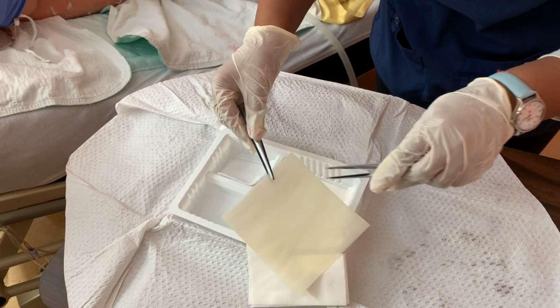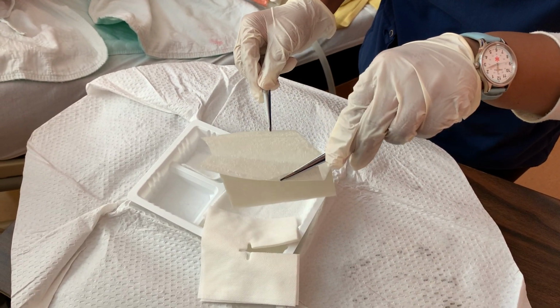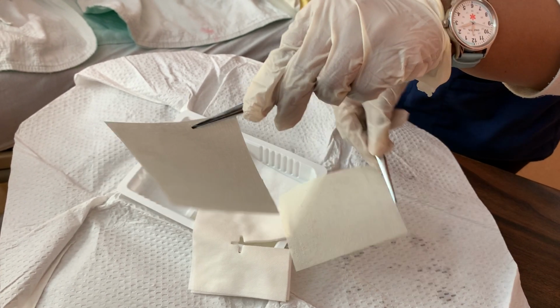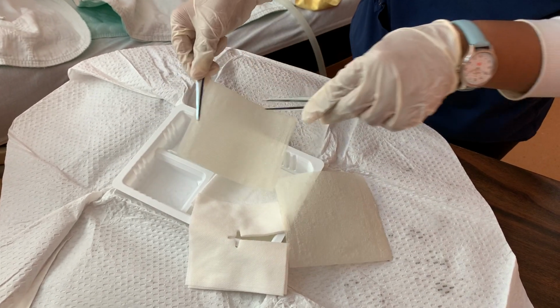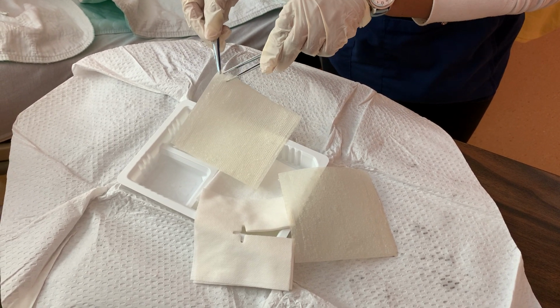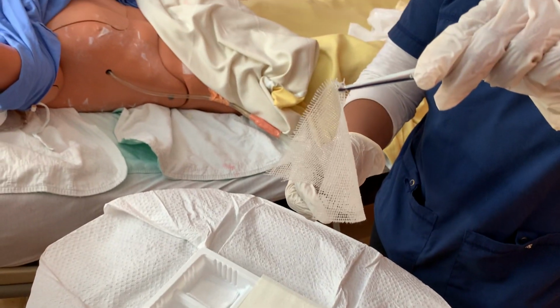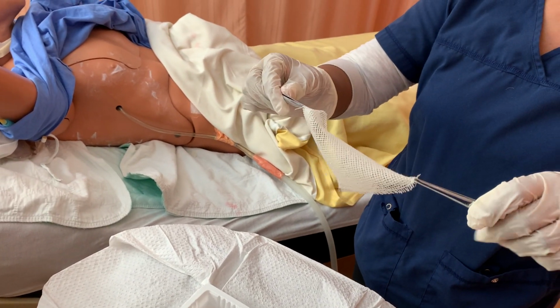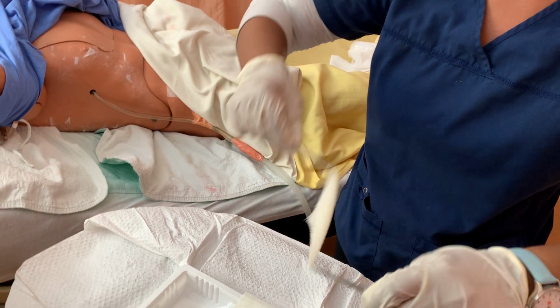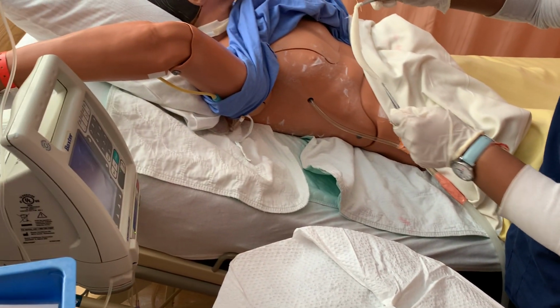I'm gonna do my Gelinette here. So this is just garbage. I guess we didn't think that through, so we had the little vials, and I think my finger might have touched this, so we're gonna pretend that I got a new Gelinette and just put it back in here. I'm gonna twirl it like this.